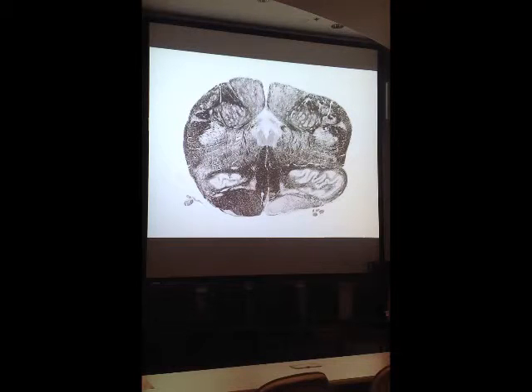And then when you get upstream in the curriculum, all of a sudden I forget his name. A senior moment. Okay. Dr. Lefebvre will expect you to know about this spinal trigeminal nucleus caudalis. So in any event, you should know this nucleus. And right next to it are still fibers of the spinal trigeminal tract. So on this slide, I think I kind of indicated what I consider most important.